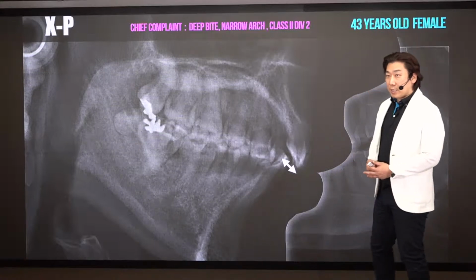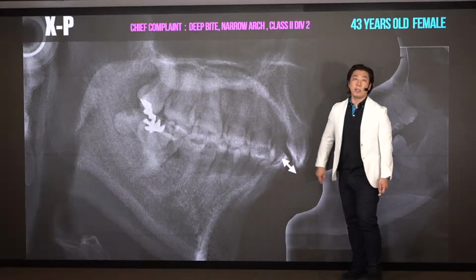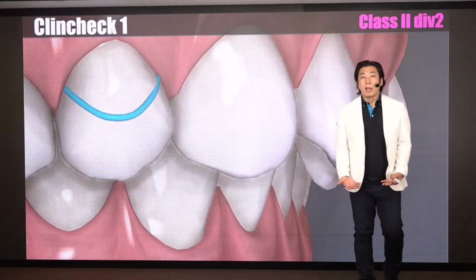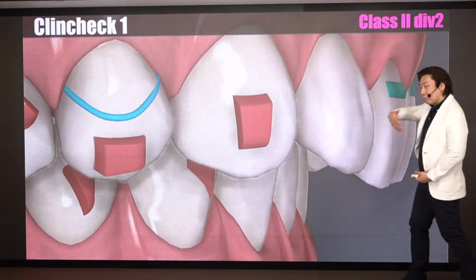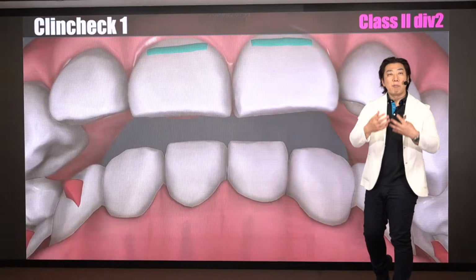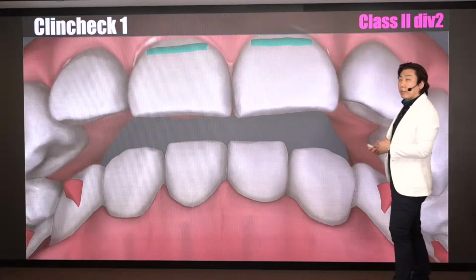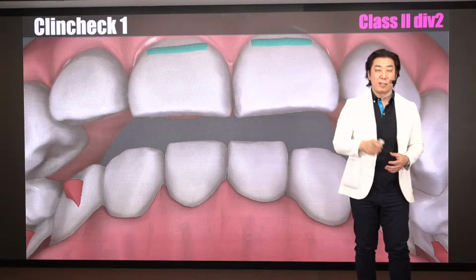My planning is this. Initially, this is the overjet. How can we prevent it? You already know. Initially like this: proclination, then naturally the patient's mandible moves forward. Then after that, we have to think about how many millimeters of distalization are needed. Okay?